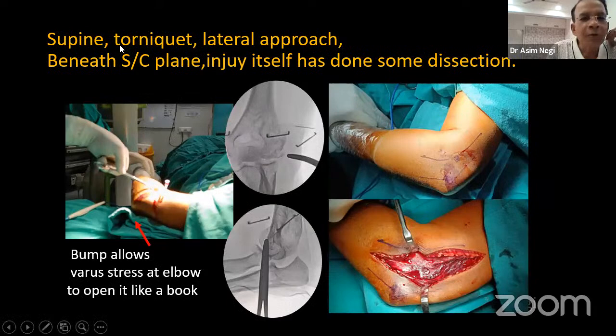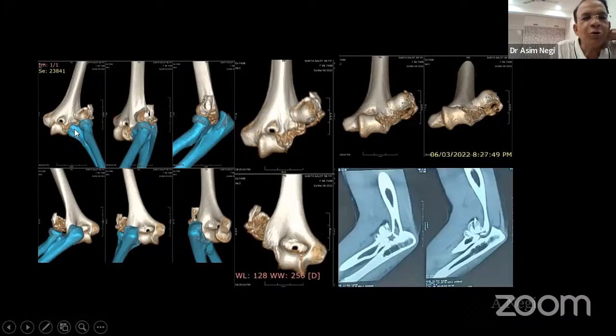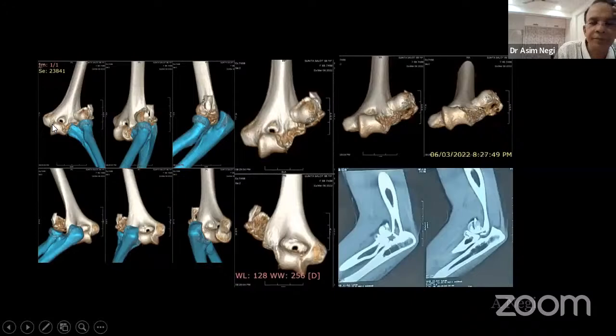Now, go back to the CT. Yeah. So you can tell us more about it. The joint is completely dislocated. Half of this, the trochlea, is intact, so this cannot be a shear fracture. Okay, a complex fracture dislocation. It involves the entire lateral condyle, which has anteriorly the capitulum, and there is an extensive comminution posteriorly. Plus the radial head also is gone. Again, the capitulum is split into two. Agreed. The major part of the trochlea is still attached to the distal humerus. So this is the understanding from the CT.